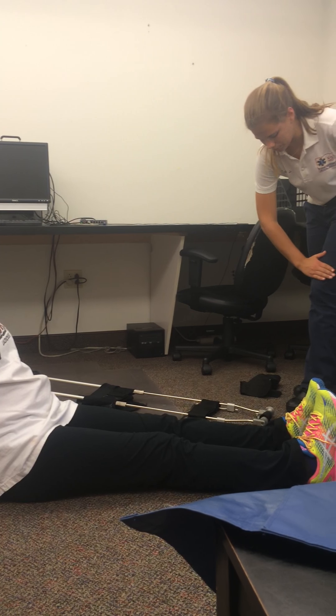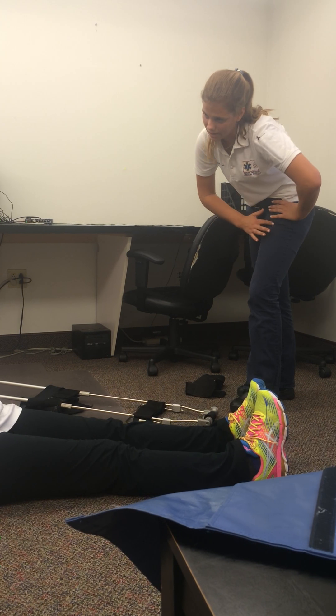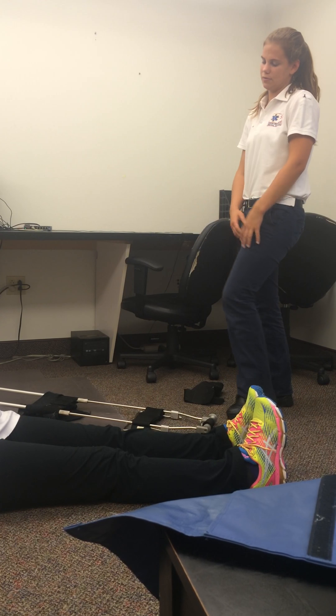As a guideline, you can put your palm right above your knee and your palm right below your pelvis. If the injury is in that area, then you can apply this — and no injuries anywhere else.